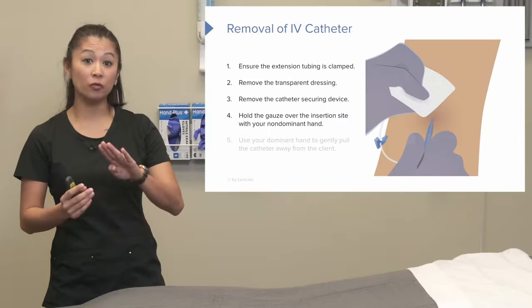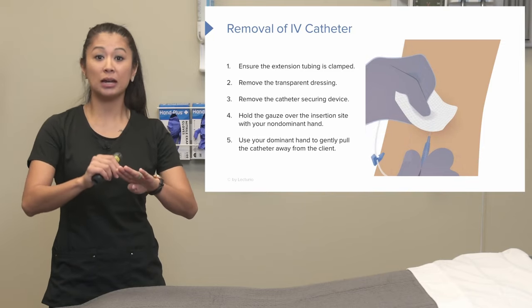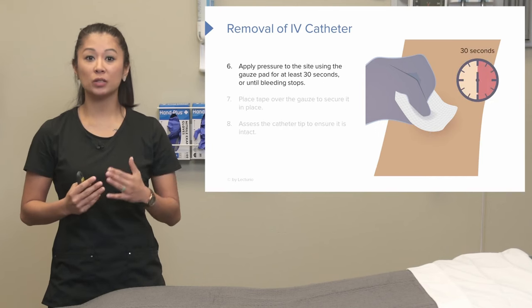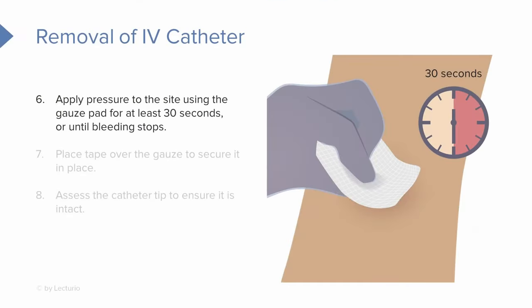We're going to hold the gauze over the insertion site with our non-dominant hand, and then use the dominant hand to gently pull the catheter away from the patient. We place the gauze over the insertion site and apply pressure to the site for at least about 30 seconds until the bleeding stops.